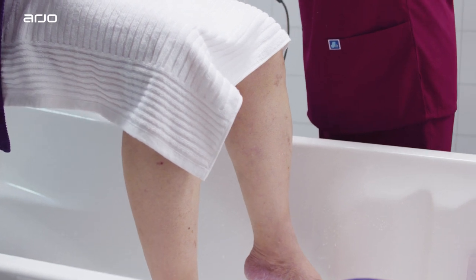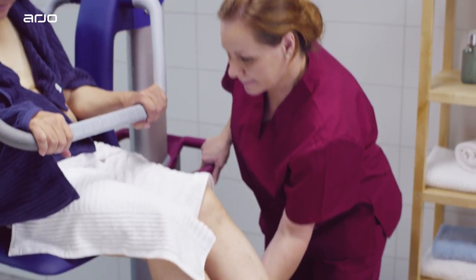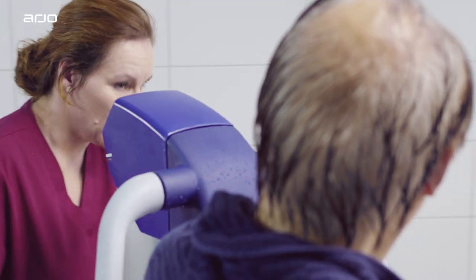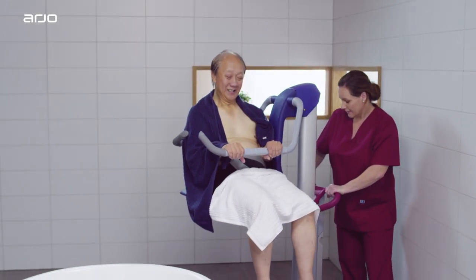After placing a dry towel or bathrobe on the resident, lower the tub to its lowest height. Raise the Alenti high enough so that the resident can safely clear the rim of the bath. Assist the resident in moving their legs over the edge of the tub while rotating the lift away. Ensure sufficient side clearance between the bath and the hygiene chair lift. You may now release the brakes and reposition the resident away from the bath.